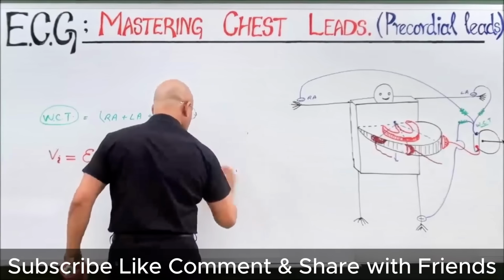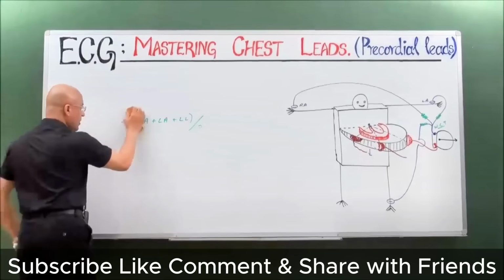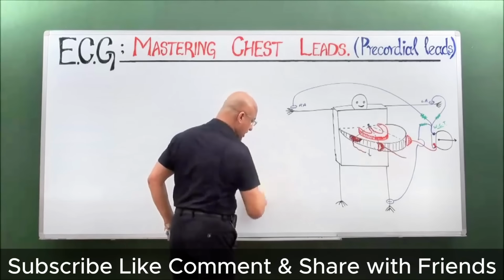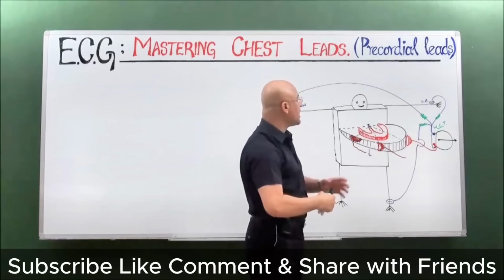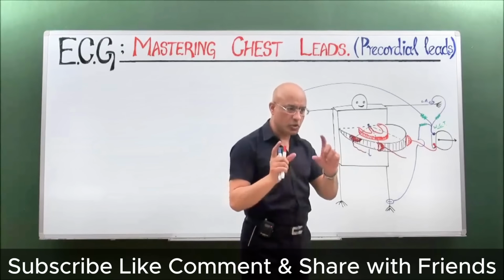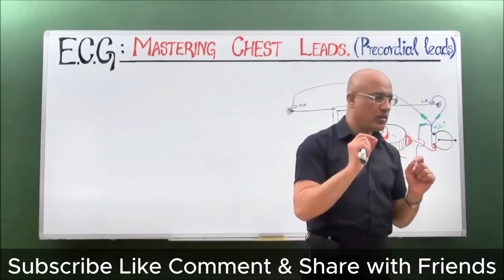Before I move forward, I want to make one more comment. During a cardiac cycle, the electrical activity produced by the heart varies at different phases.